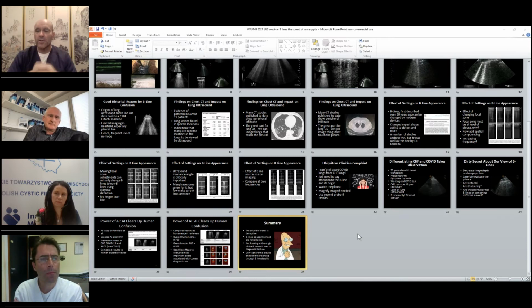Yeah, and as you mentioned, it increases with abnormal findings, with 3 being disrupted pleura with coalesced B lines or reverberation artifacts, and 2 being multiple reverberation artifacts. Once you have the coalescence and widening, that gets you the highest score. And then obviously the more lung zones you have with 3, the more significant the abnormality.